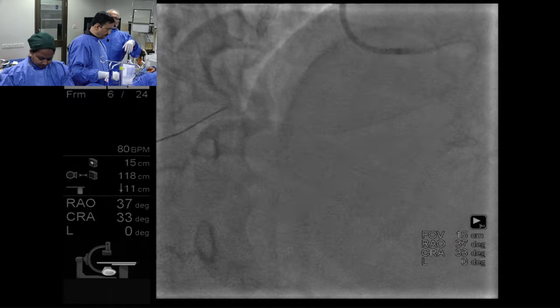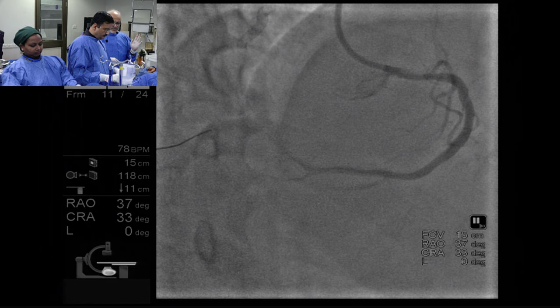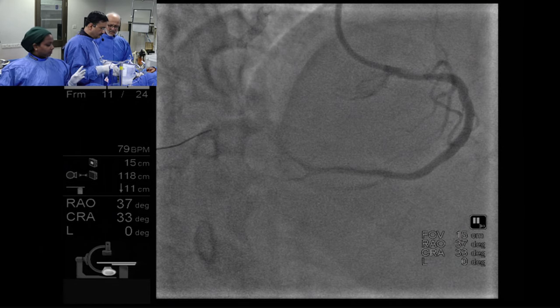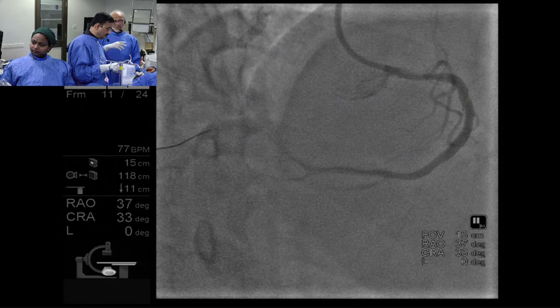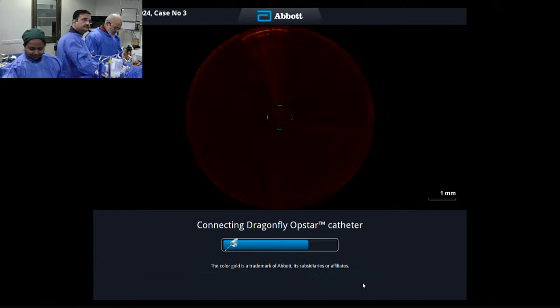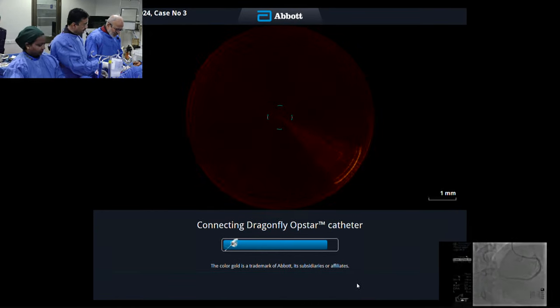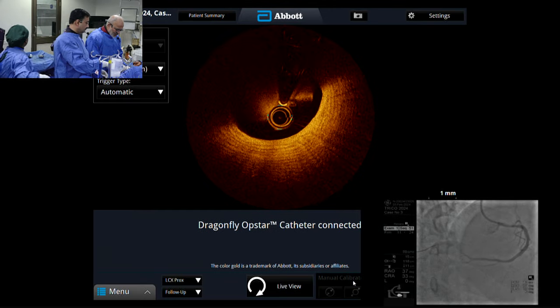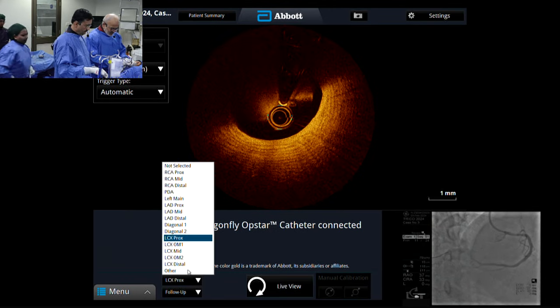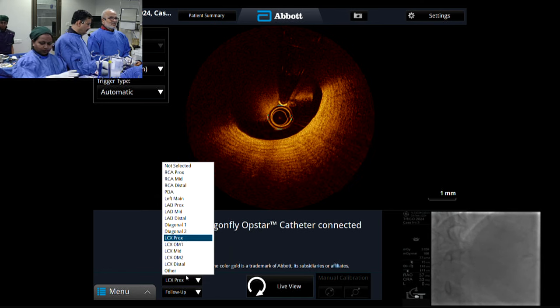But there is nothing wrong with it. This is all calcium and stable plaque, fibrocalcific. This is exactly like what you saw in the ostial LAD, hopefully. And it is not significant. But I think they are probably concerned about some big dissection, right? This is not an unstable plaque.